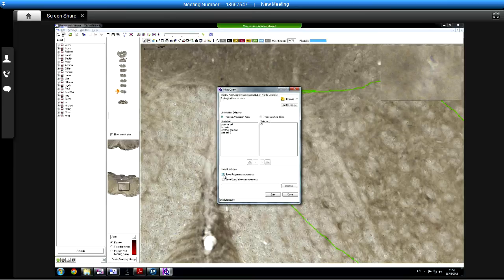Cumulative, I think. I will check on this. We'll generate them all. I'll double check this because I keep forgetting. Is, I think, the object specific. I have asked for this to be changed many times, and it never seems to get changed. And then this third one here, save for single CSV.